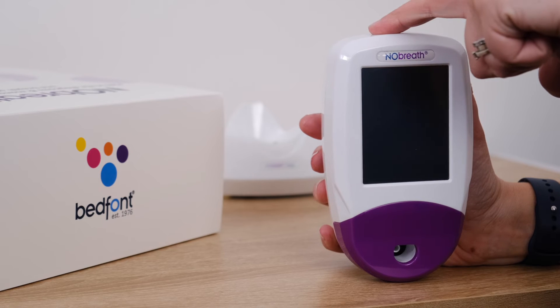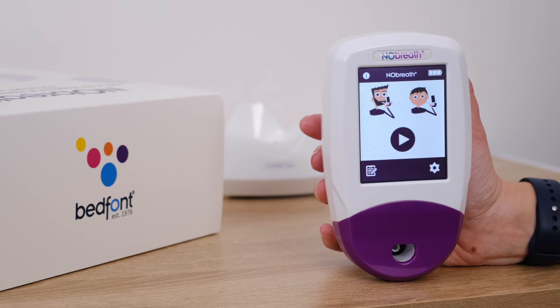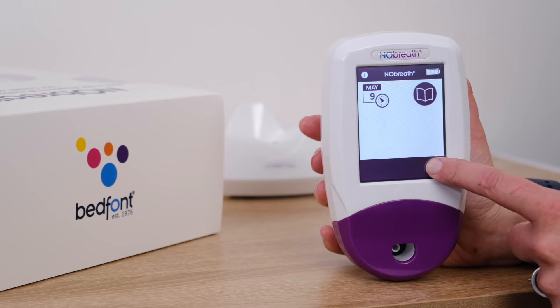Once the device is fully charged, press the power button to turn the device on. Before we begin, it's important to set the date and time. Press the menu button, followed by the time and date icon.